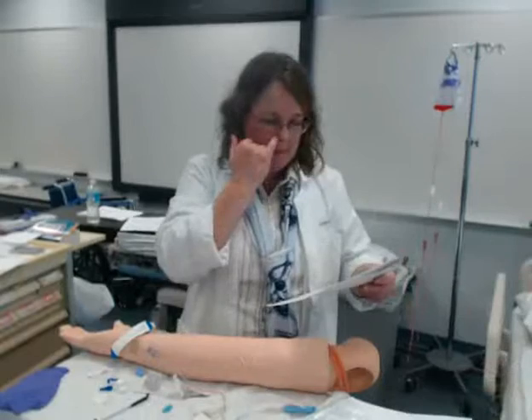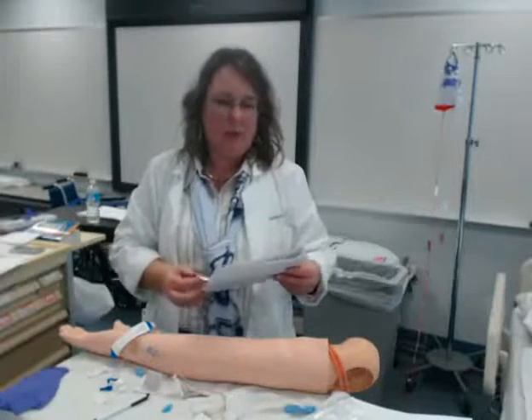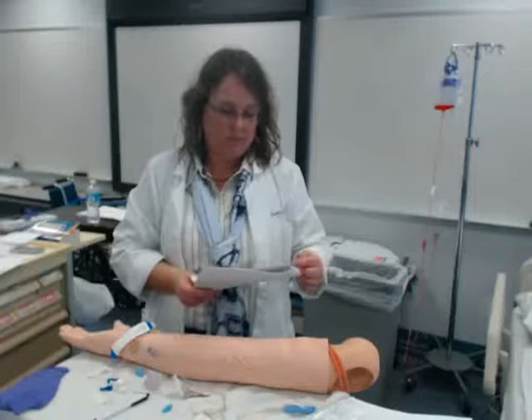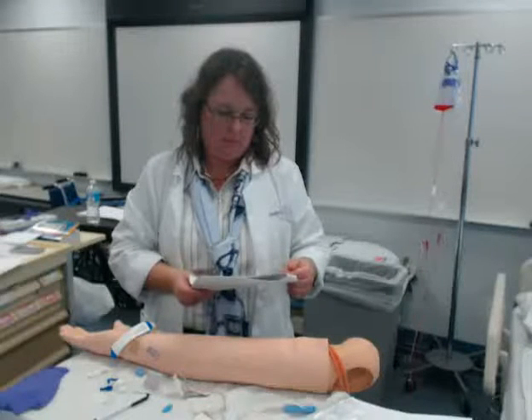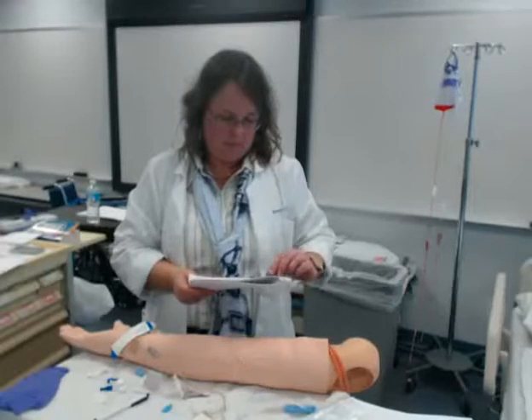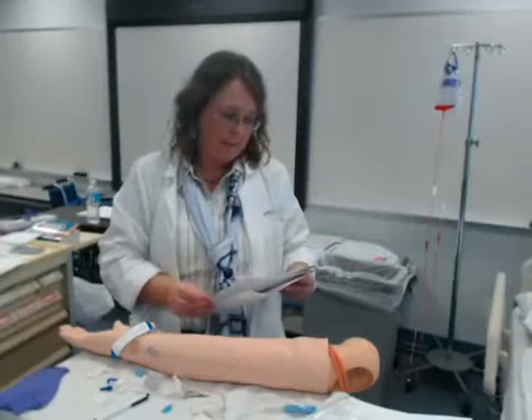The question was, when do I use the rest of this saline? If I'm running a primary line, I would not need to use it because it's continuously running. But if it was just an antibiotic and I was going to disconnect it again, I would then flush with the rest of my saline after my 45 minutes was up.